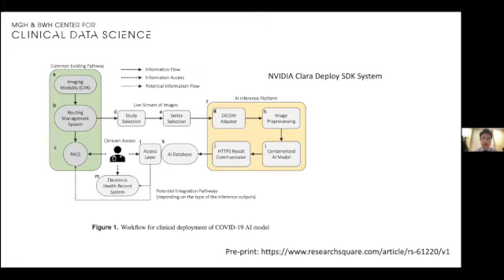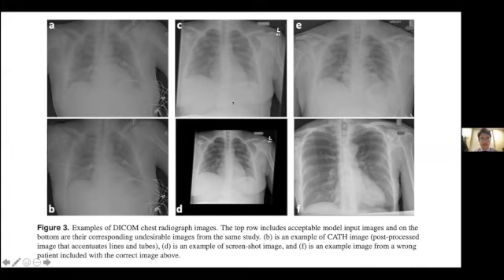So when you think of a radiology study, for example, a chest X-ray, the chest X-ray file or study may often have more than one image. You can have a frontal X-ray, you could have a lateral radiograph, you can have different kinds of post-processed images. For example, here in image A is the regular frontal chest radiograph. In image B, it may be hard to appreciate, but a post-processing filter has been applied to this image to help accentuate catheters and lines. And that really just changes the nature of the actual image.